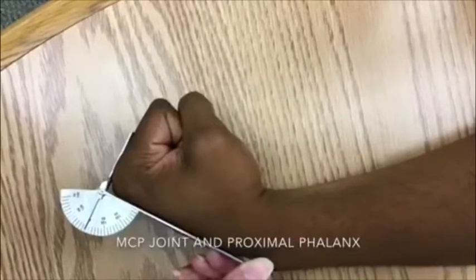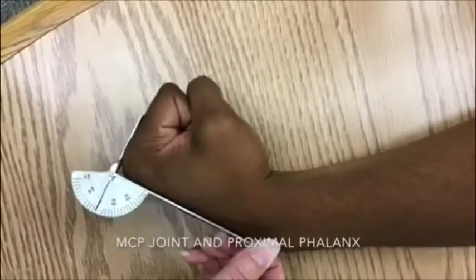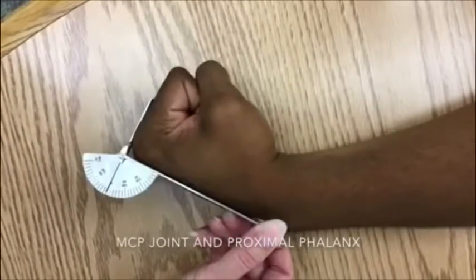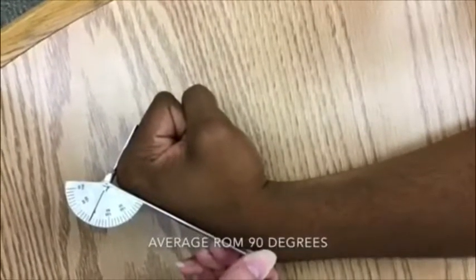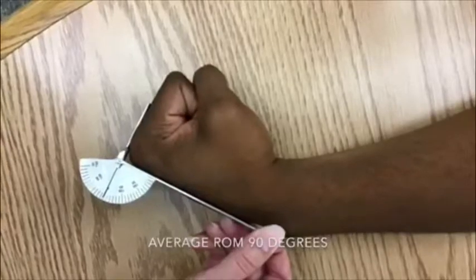Have the patient make a fist. Adjust the movable arm of the goniometer so that it is parallel to the longitudinal axis of the proximal phalanx. This patient measures at 90 degrees metacarpophalangeal flexion, which is the average range of motion.